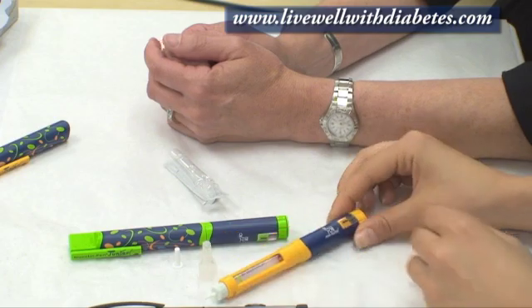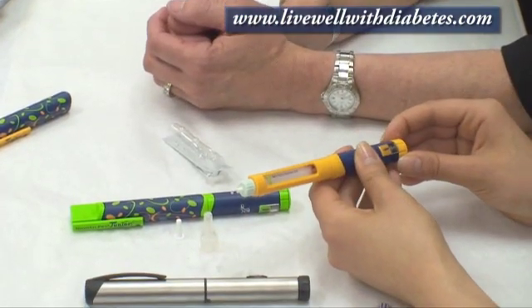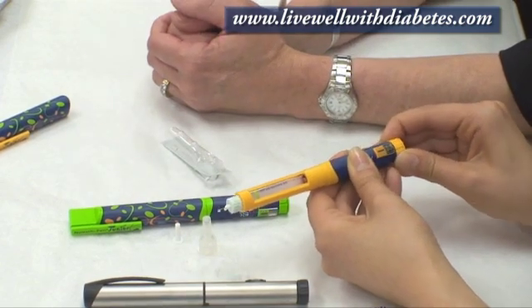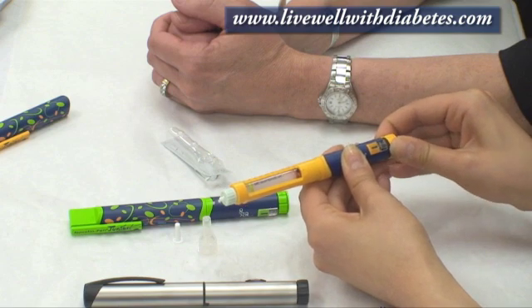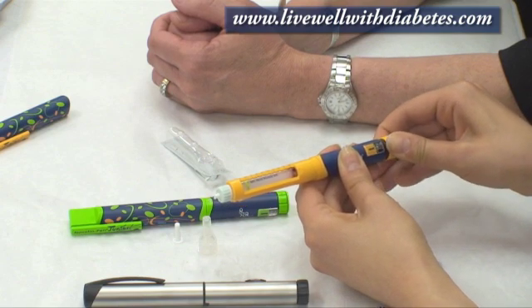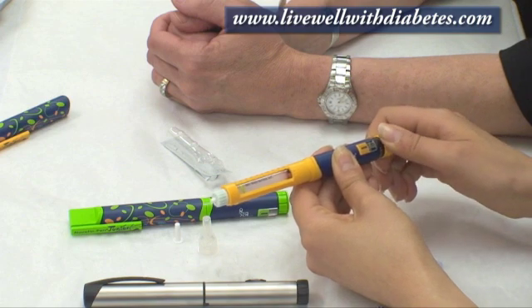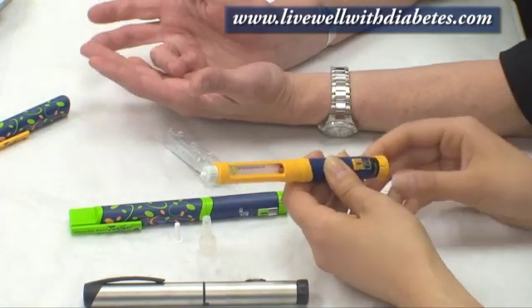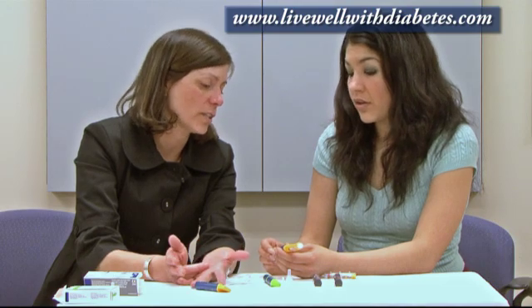Let's say you're ready to dial your dose of insulin and you dial up to eight. Now let's say you think, oh no, it wasn't supposed to be eight, it was supposed to be six — you made a mistake and dialed too much insulin. With this pen, you can't dial back.